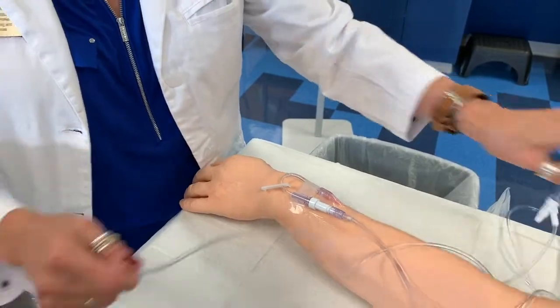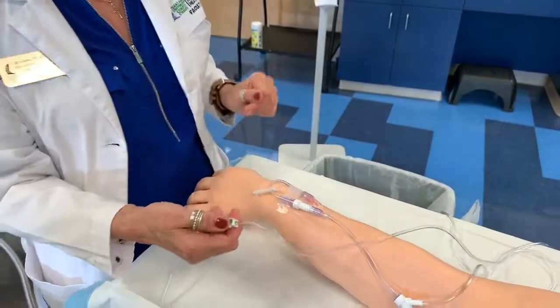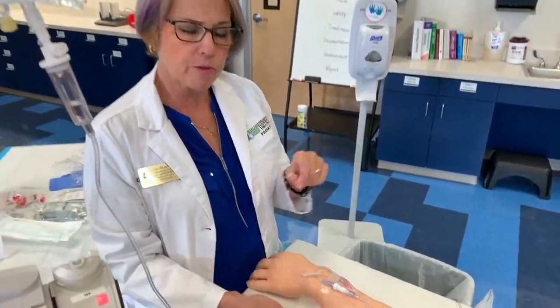Now, we want to go ahead and figure out our drops per minute and how many drops we need to count. So what I want you to do is calculate what your drop factor or your drip rate will be in drops per minute. So you have 100 milliliters an hour of fluids with 15 drops per milliliter, and you want to figure out how many drops per minute. So I want you to take a couple seconds and figure out your dosage calculation.